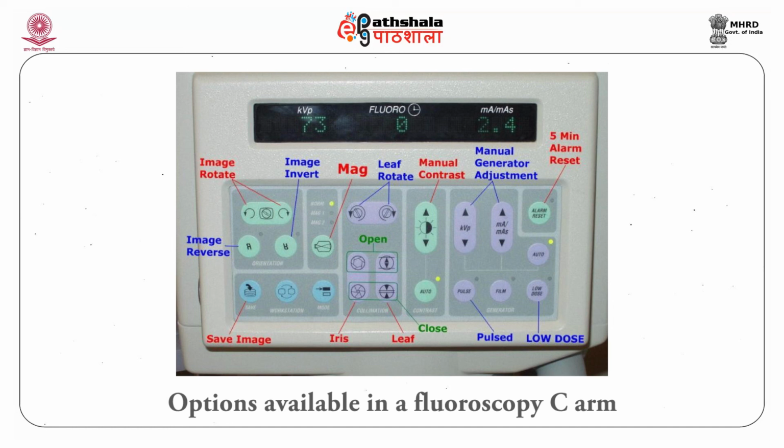Acknowledge fluoroscopic timing alerts during procedure, such as the integrated timer. After procedure, record and review the dose. Ensure appropriate monitoring of dosimeters. Arrange for appropriate follow-up and discharge instruction for high dose procedures.